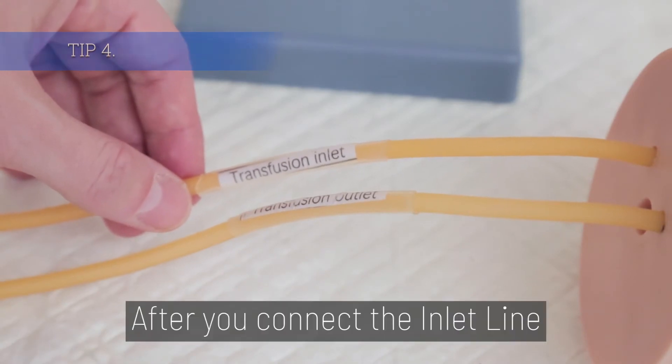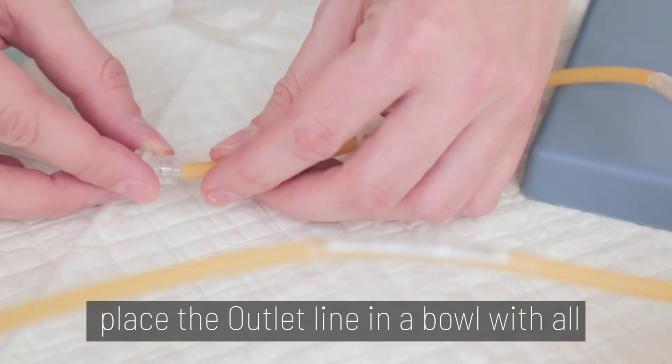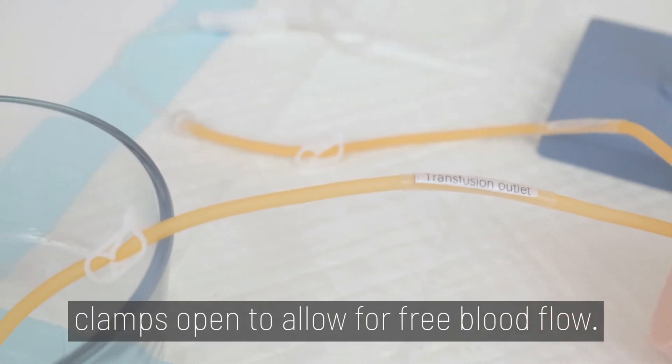Tip 4. After you connect the inlet line, place the outlet line in a bowl with all clamps open to allow for free blood flow.